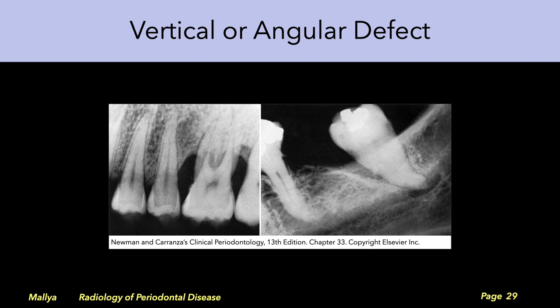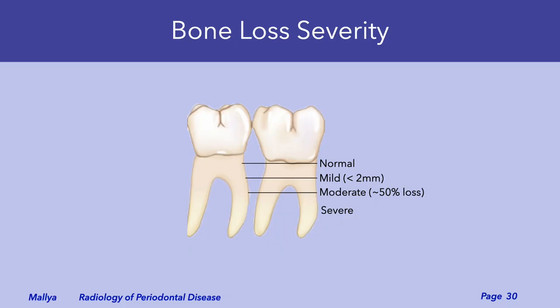These radiographs demonstrate vertical bone loss. Note how the margin of bone is oblique and at an angle to the tooth surface. In addition to categorizing the pattern of bone loss, radiographs also help assess the severity. Mild bone loss is when there's approximately 2 mm of bone loss. Moderate bone loss is when the bone extends to approximately 50% of the root length, and bone loss greater than this level is considered severe.